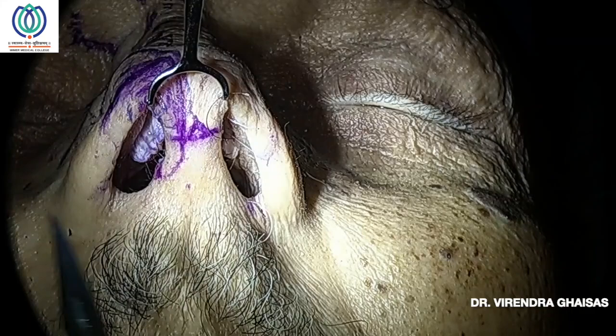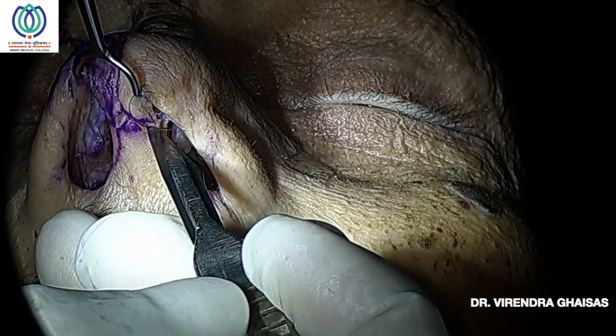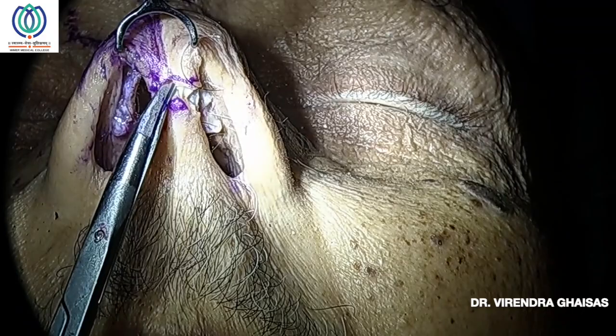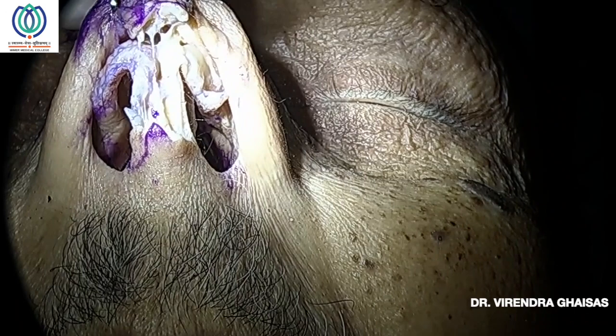A columellar incision is an inverted V incision taken at the narrowest portion of the columella. What happens is when there is fibrosis, this inverted V lengthens and the scar becomes really faint, whereas a straight line incision is seen by the human eye, and a scar which is broken is not easily seen by the human eye. So that's the principle of taking the inverted V incision. It's much more preferred than a stepladder incision or a straight incision.